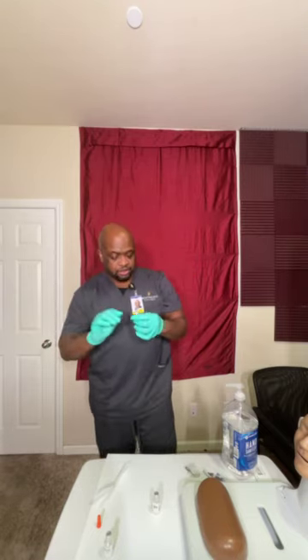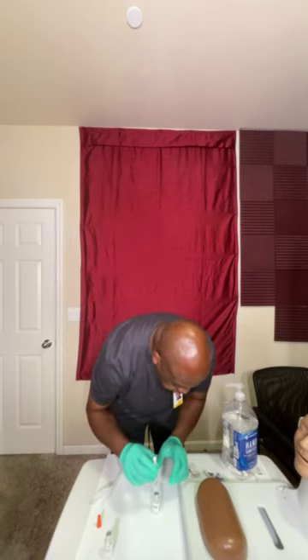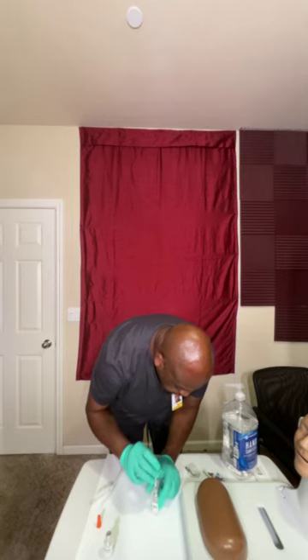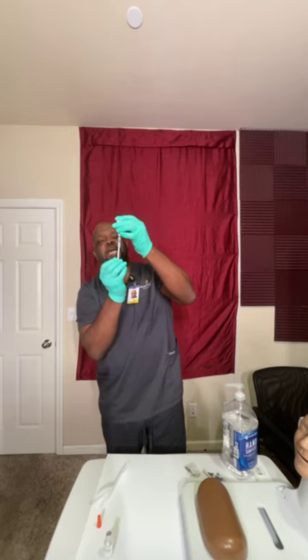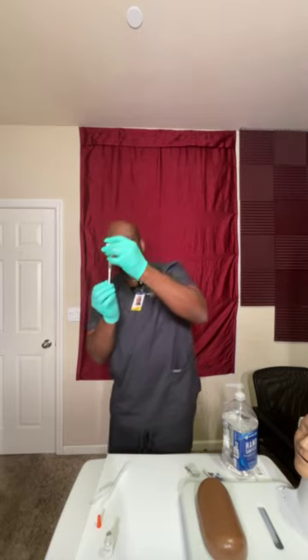Now, on this part, we want to make sure that we put the syringe into the NPH, and we are going to make sure that we invert, and we are not going to press on the actual syringe because we don't want to mix it. And now we're going to pull in at least 8 units this time, making it a total of 10. Good, that's right on the dot. Making it a total of 10.